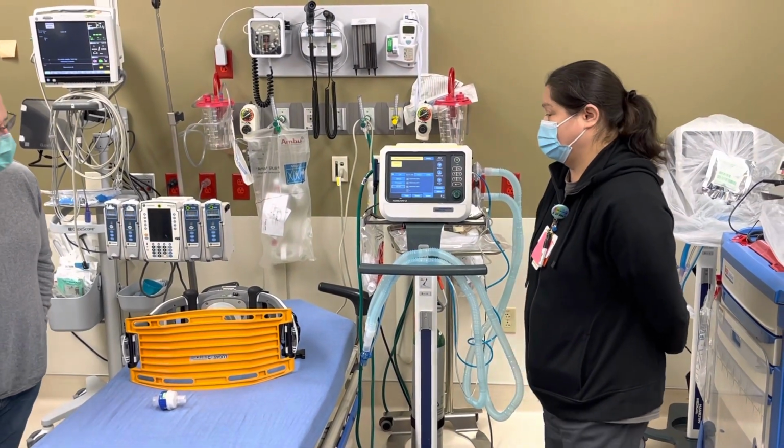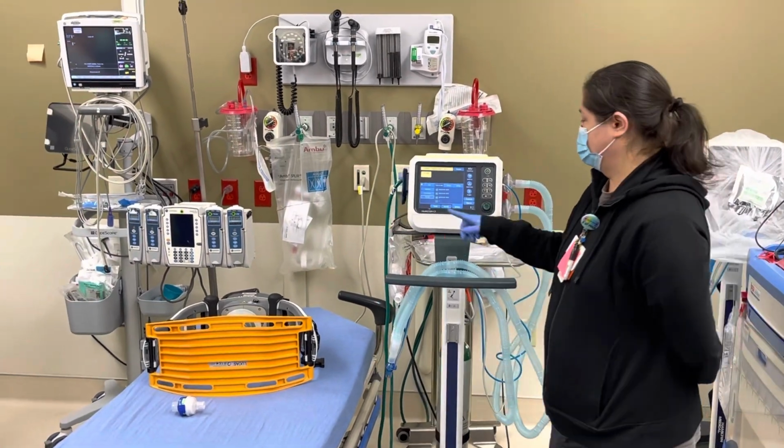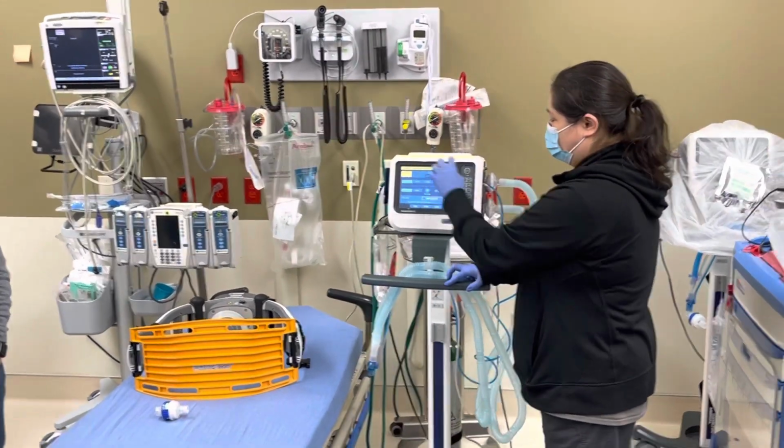All right, so you're good to go. So as long as you have all your checks, then you're good to go. And you can X out of this one, which would be that little button right here. And then you can go into your modes.